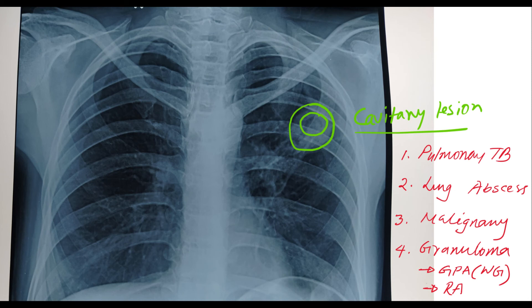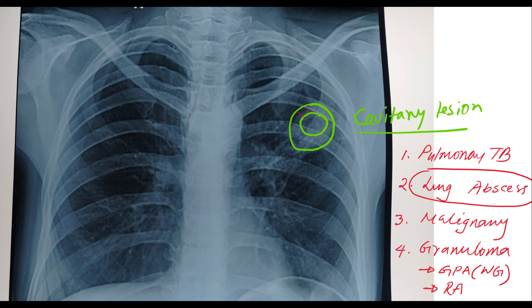Actually, in this patient, this cavitary lesion is due to lung abscess. Clinically, this patient was presented with high-grade fever for five to seven days, with left-sided chest pain and also chills and rigor. And radiologically, look at the lesion — the wall is very thick and inhomogeneous, and there is a definitive radiolucent area in the middle of the lesion.